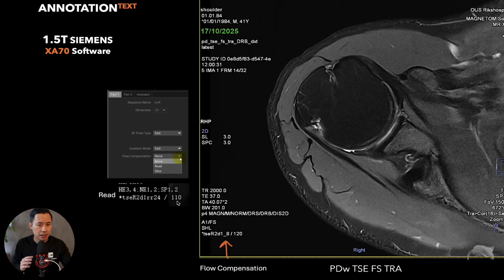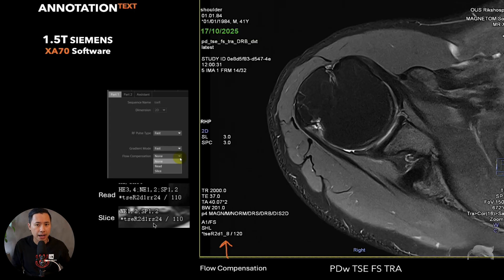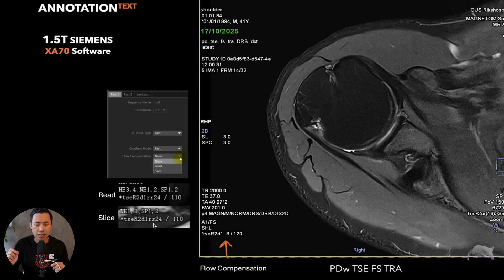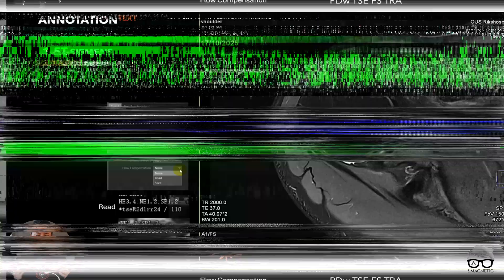If we use flow compensation in the slice direction it would look the same but now 'R' then 'S' - where S means slice direction. That's the difference between read and slice flow compensation in the annotation text.